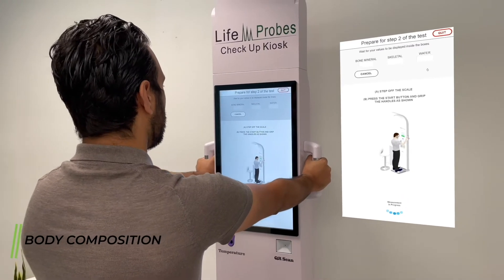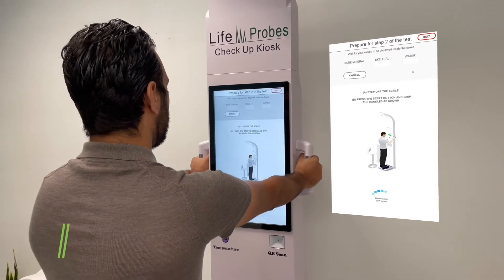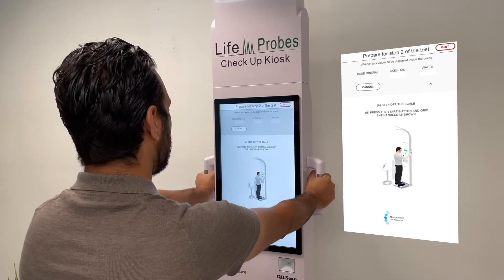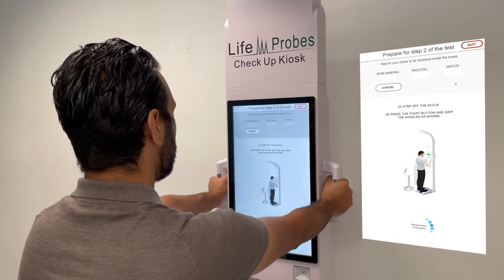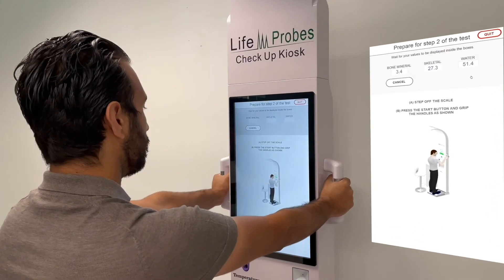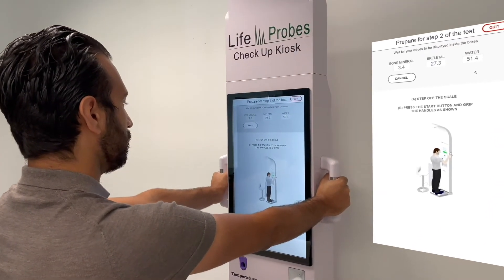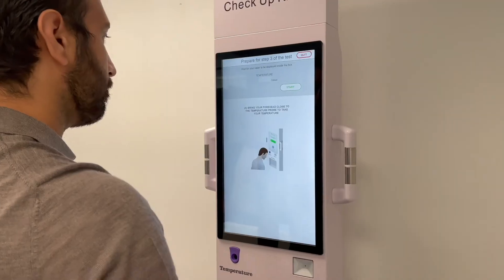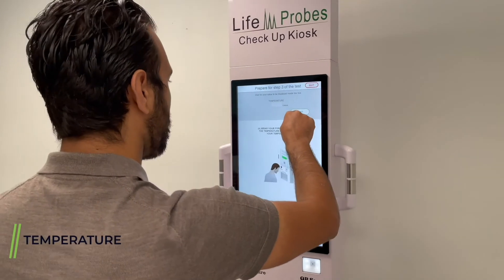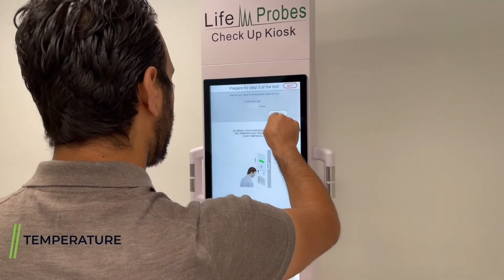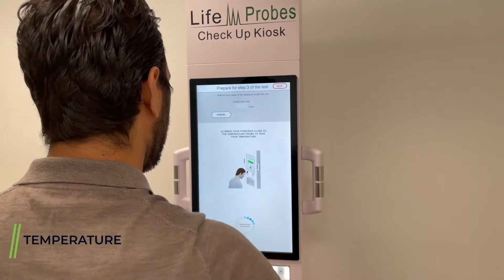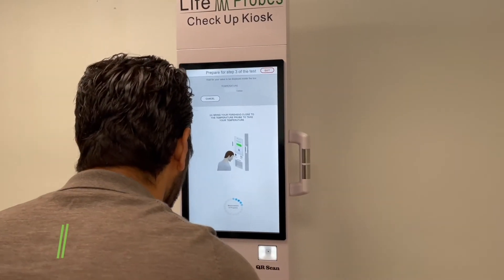Phase two of the exam: estimated body composition. According to your height, standing on the floor or on the scale, press the start button, then quickly hold the handles as shown. Keep holding until the results show on the screen. The measurement is complete.